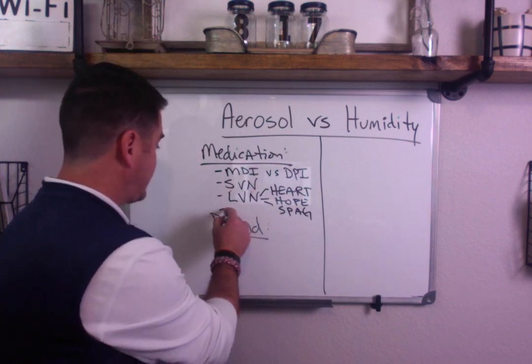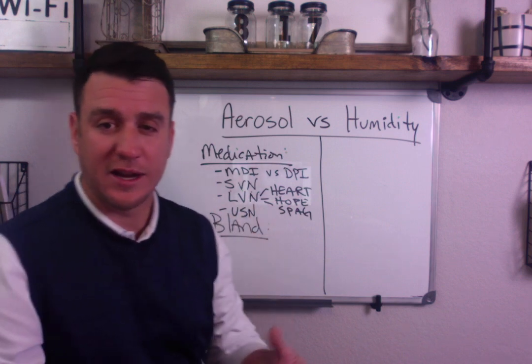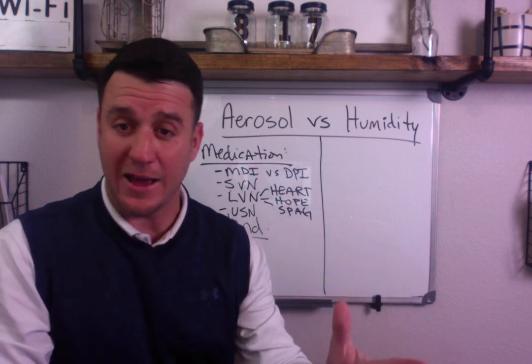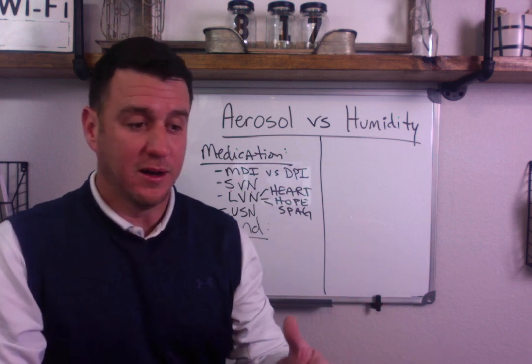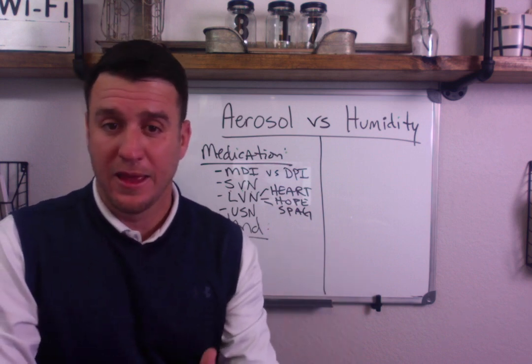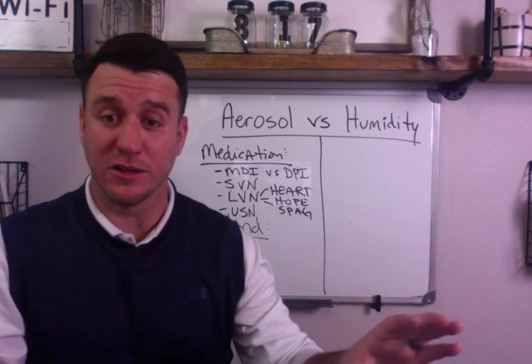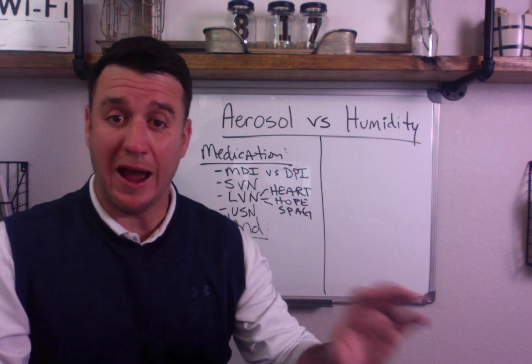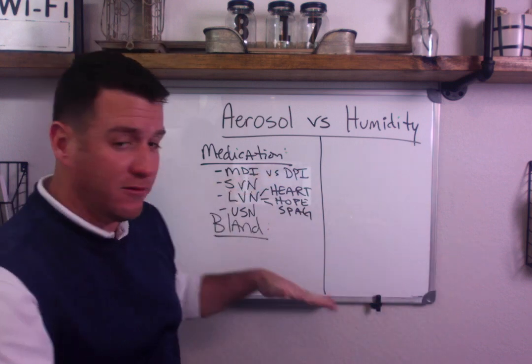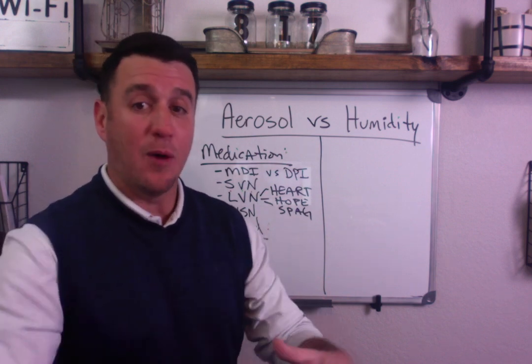Now from there, we have the ultrasonic nebulizer. The ultrasonic nebulizer works off of a principle not of a flow of gas. This is typically powered by either batteries or electrical source. And what the ultrasonic nebulizer does is it maximizes output of aerosol particles. So the output is much greater than that of an SVN and an LVN. The particle sizes are typically much smaller, and the output is much greater.